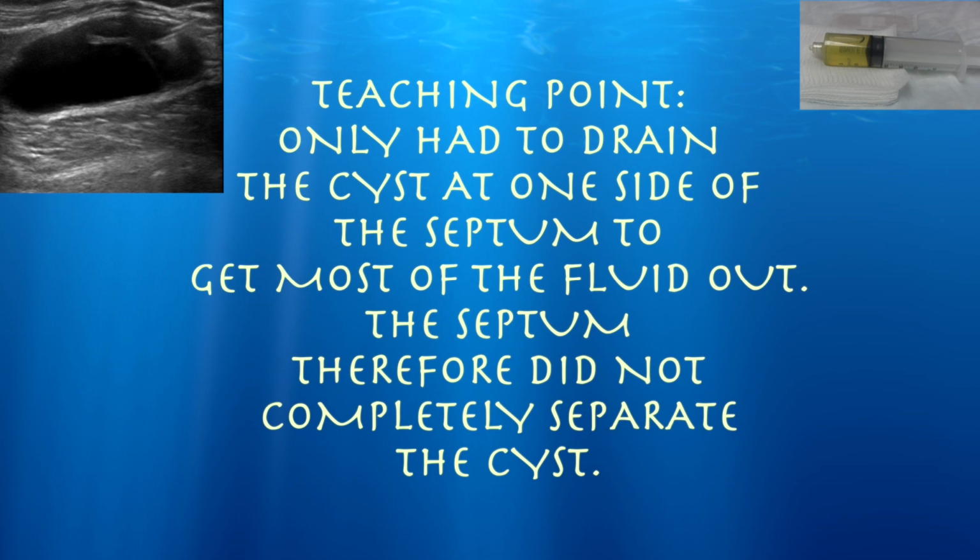And again, teaching point is that on this case, we did not have to go through the septum in order to essentially drain the whole cyst.